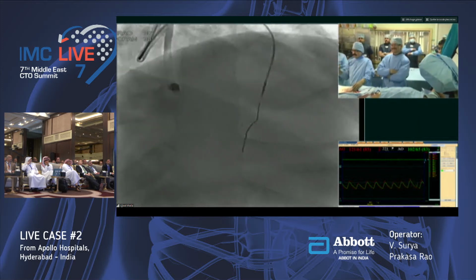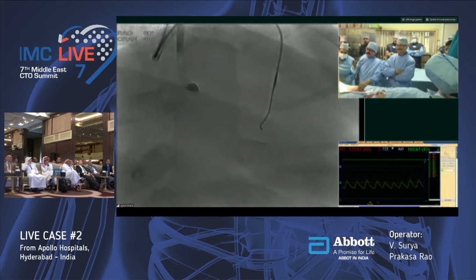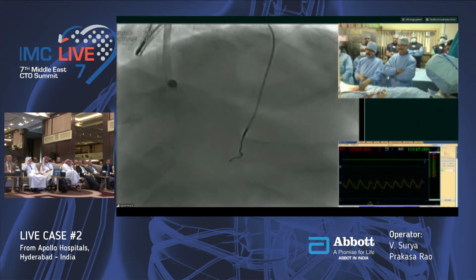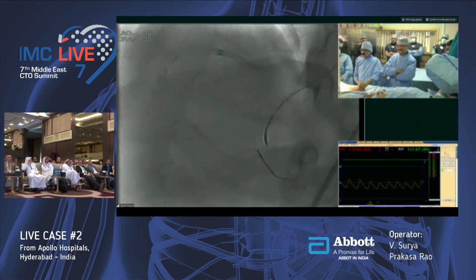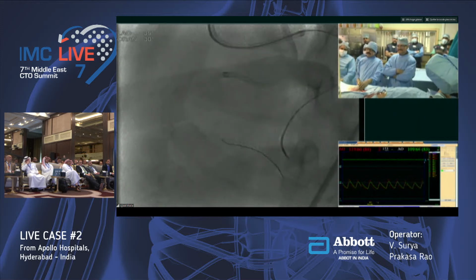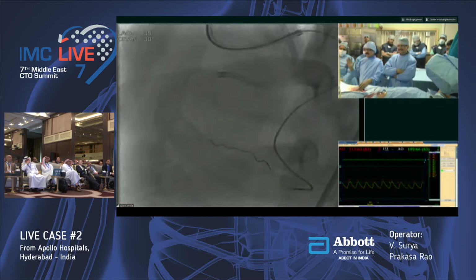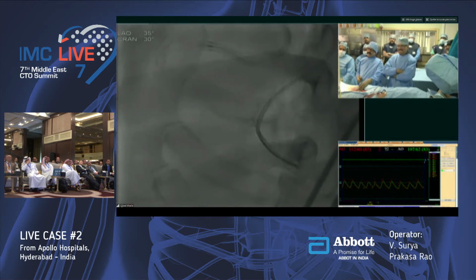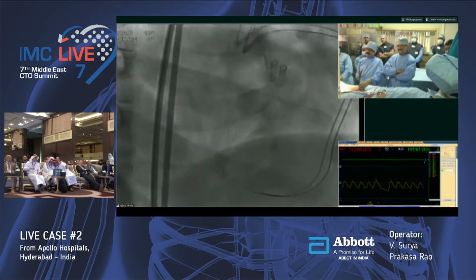Because this is an in-stent CTO, we have to discuss the distal landing zone, because this is a bifurcation. We have to assess by the angio if we have contrast inside the stent, because in that setting we can discuss an adequate approach. We also have to discuss the way to try to reopen both branches, because there is a PDA and a posterolateral branch. It could be very interesting to better discuss the strategy before beginning, because here the major risk is to lose the RV branch.